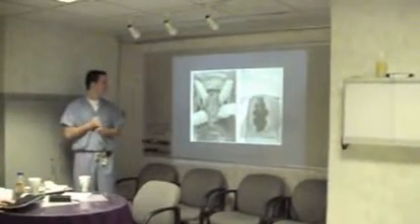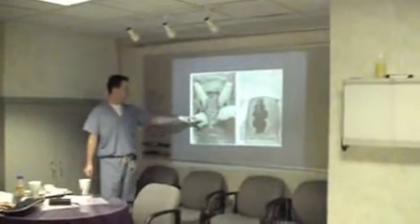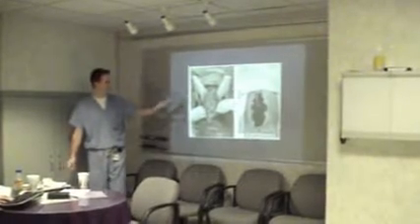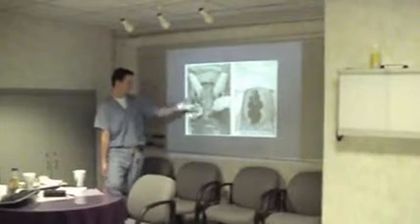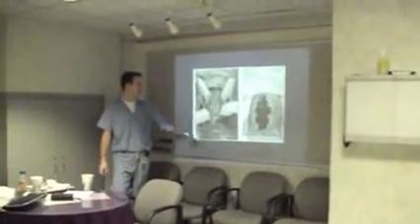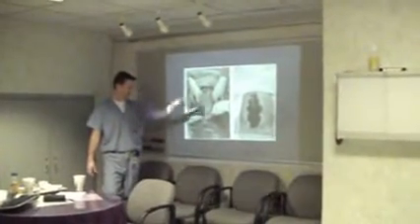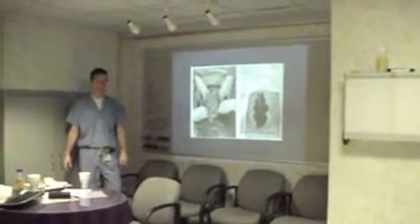This is a picture of the wound vac. This is not the exact one that we have these days. This is like the first phase. Basically, you have to cover the viscera of the abdomen, protect it from the vac suction device. Place a sponge, loose suture over top of it.